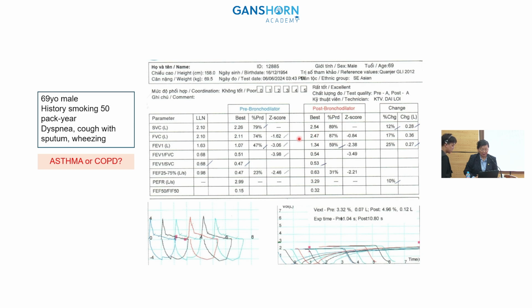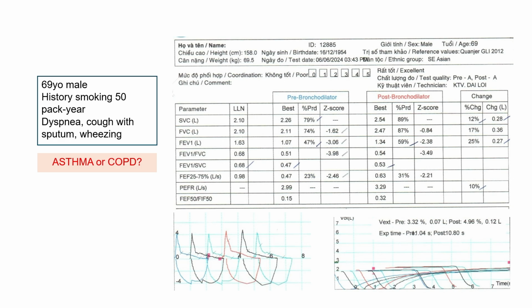So please take a look at the bronchodilator test. Is it positive? Yeah, positive. The bronchodilator test is positive, and FEV1 is also positive.